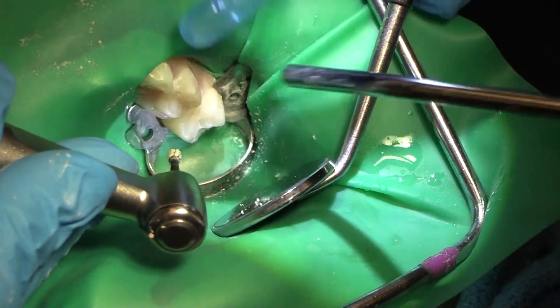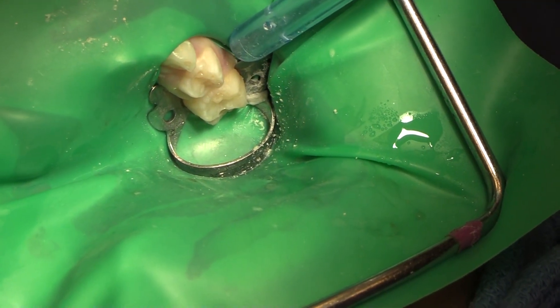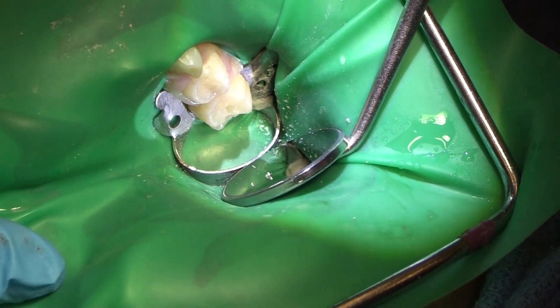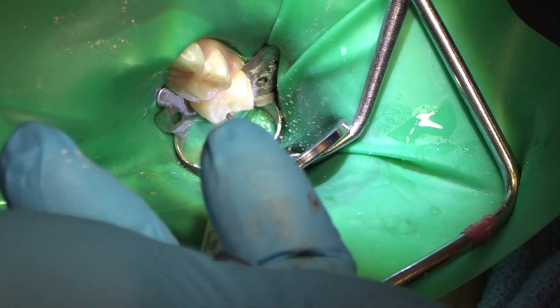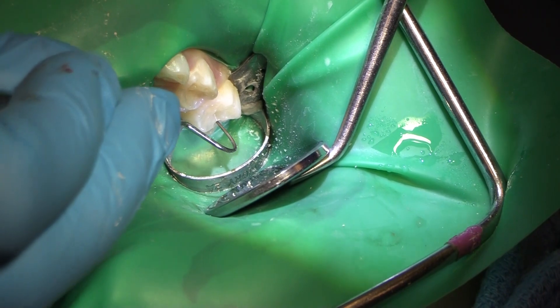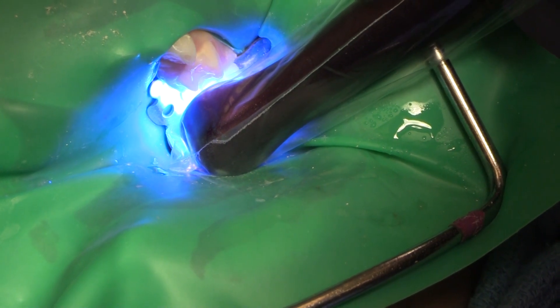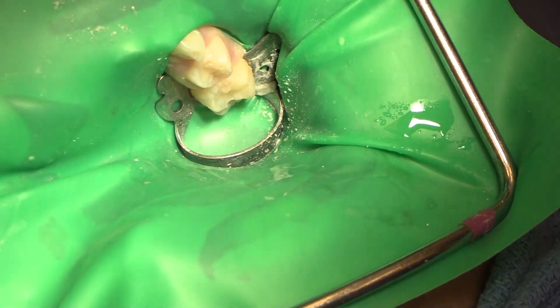We're deep, but not beyond what's reasonable. I'm going to put a little bit of Theracal base down at the bottom of that restoration before we put our composite in, just to give it a liner and a little added benefit. The Theracal LC is a calcium silicate and resin material — it's light cure. There's also a Theracal PT that's just come to market for pulpotomies, but this Theracal LC is for our liner. We're going to light cure that, and while we're doing that I'll get our little bands ready as we switch back from crowns to matrices.